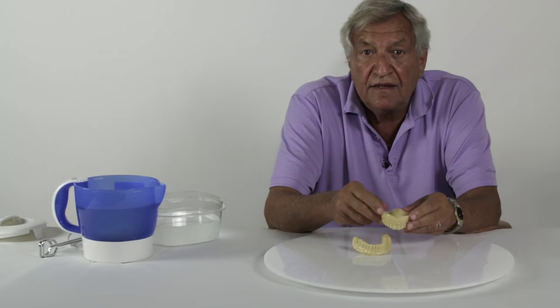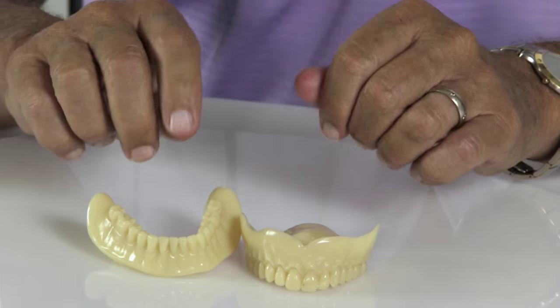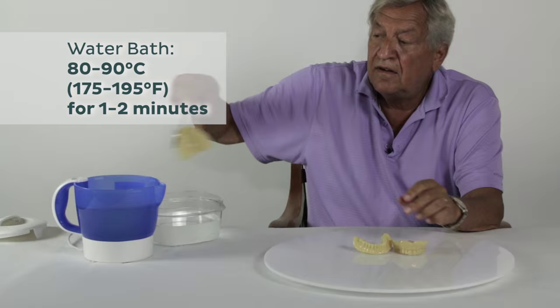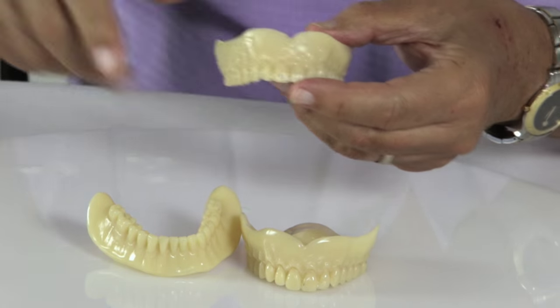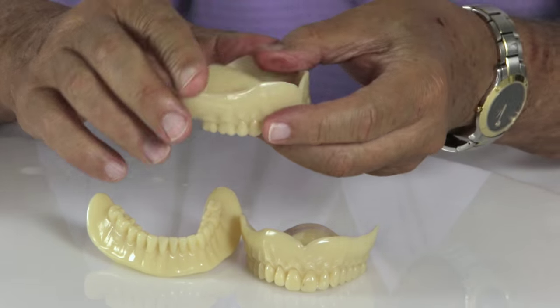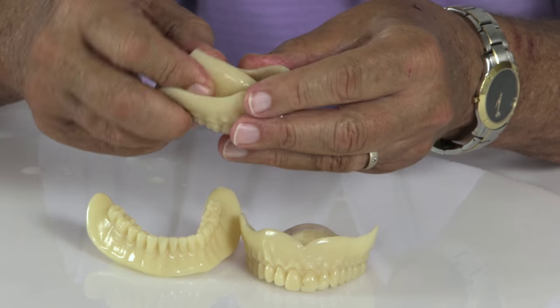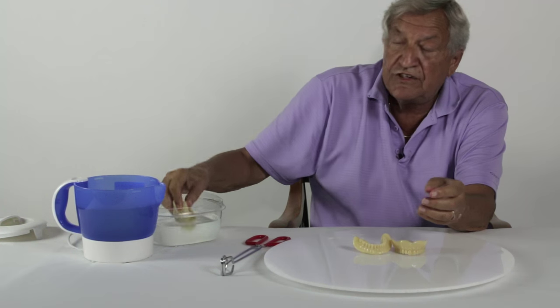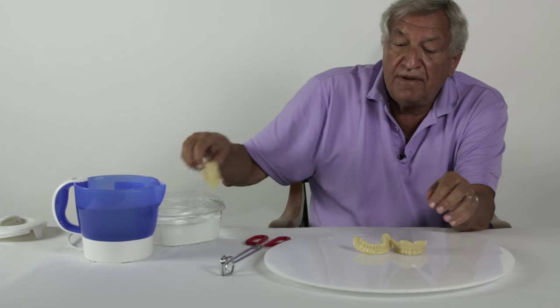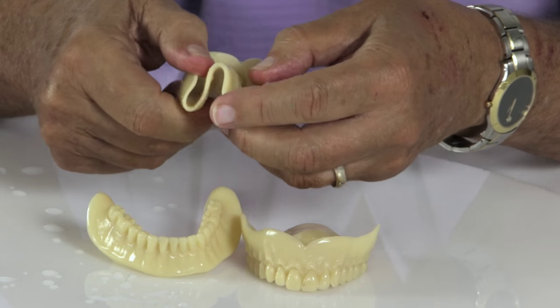They're made of PMMA, so they are totally stable. When they are placed in warm water, they become completely moldable. They can be molded in the mouth or on a model. Once they are put in the position that the clinician desires, they are chilled in cold tap water, and once that is accomplished, they become totally stable and will not change unless they are reheated.